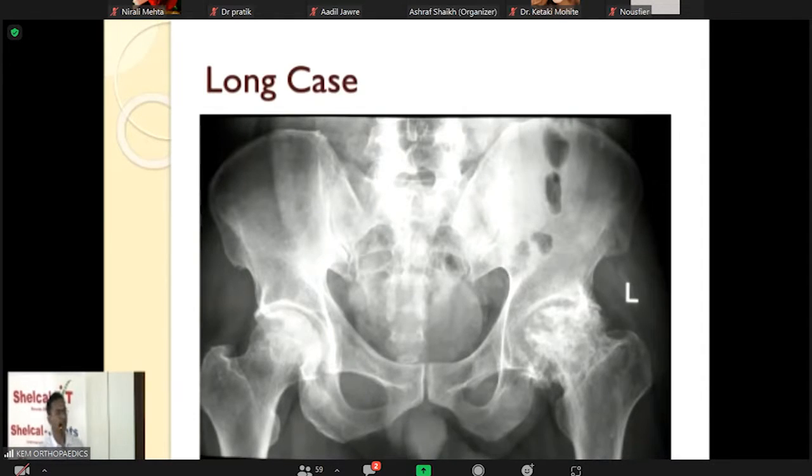This is an X-ray of the pelvis with both hips. No need to say sacrum and all. Yeah. With adequate exposure. The left hip joint is sclerosed. The left femoral head is sclerosed with an irregular head. Yeah. Loss of sphericity. Correct. Joint space is decreased. Shenton's arc.